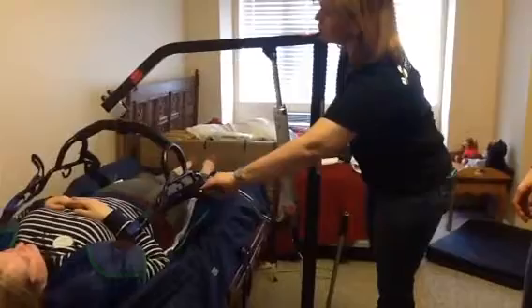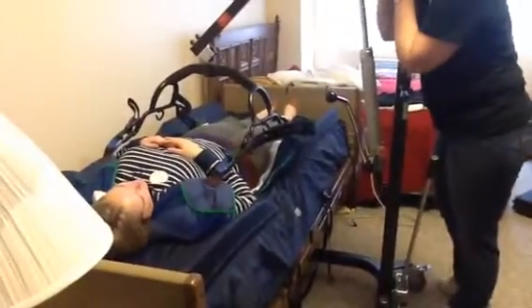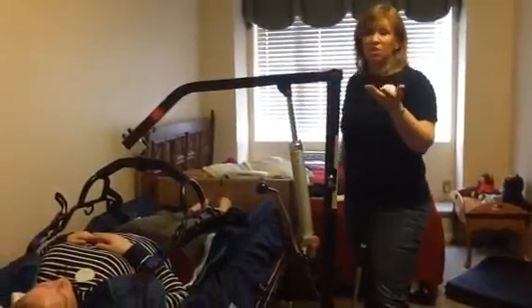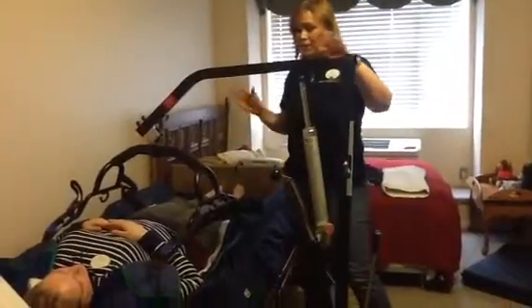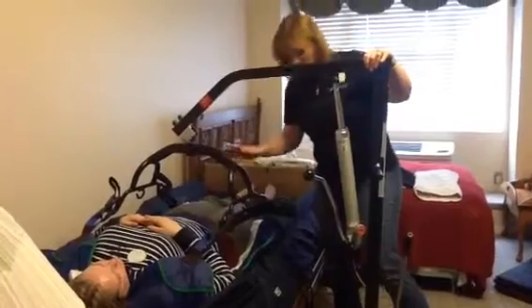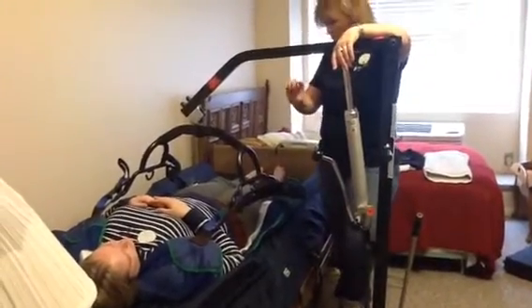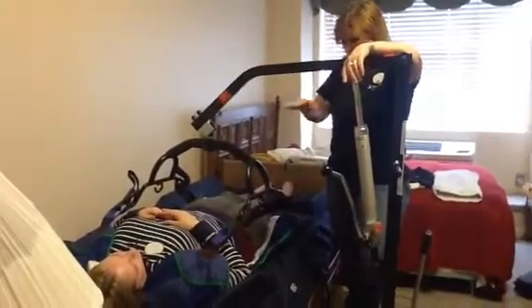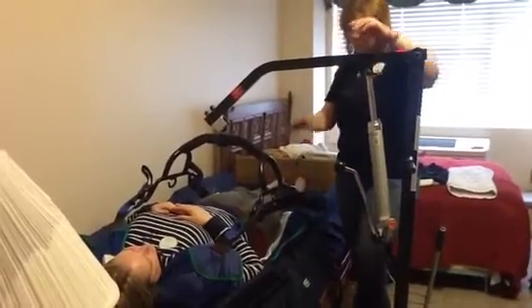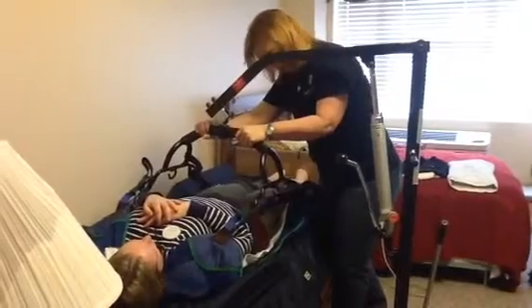This is a manual lift, so once you get them looped up, you're going to tell your resident what you're doing. This is very scary for them. You're about to lift them in the air, they're going to fly, so you want to let them know not to be scared or nervous, that you're right here with them and exactly what you're doing. Miss Griffin, we're going to lift you off the bed, but we're only going to lift you as far as we need to. You only need to come till we clear the bed so we can get you in your chair. Don't need to worry, we're right here. It's safe. You can put your arms on your chest if you want to. If you get too scared, you can hold on up here, okay?